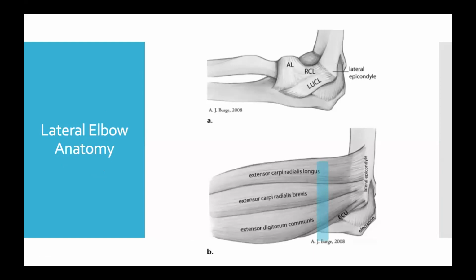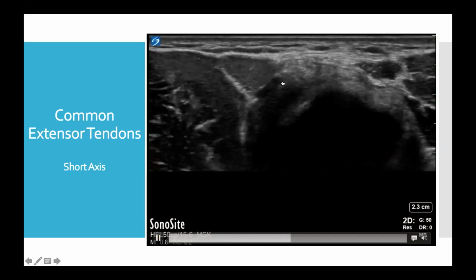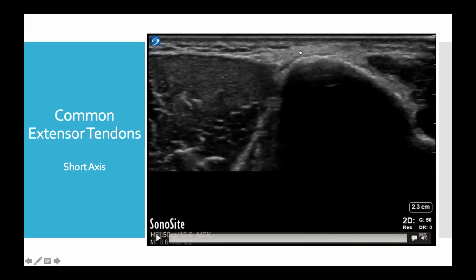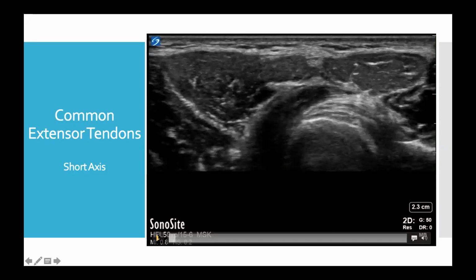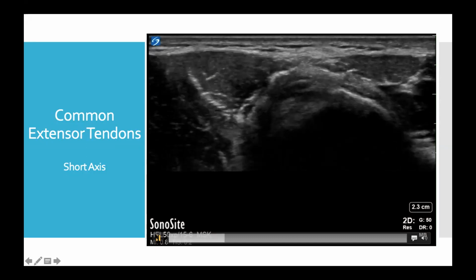We move on to short axis examination of the same area, and I've found this most useful just to scrutinize for bony abnormalities and cortical change, but you can still see some of the insertion points of these tendons there. You can see the lateral epicondyle come into view here, and as they bundle up and insert onto the epicondyle right there. If we start from the beginning, in this region we're looking at extensor carpi radialis brevis, digitorum communis, and extensor carpi ulnaris, and as they come in, they all insert onto the lateral epicondyle.